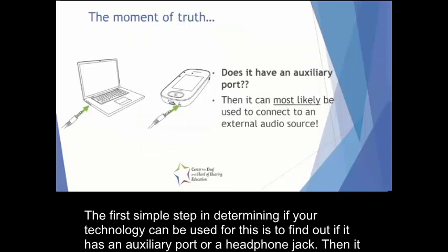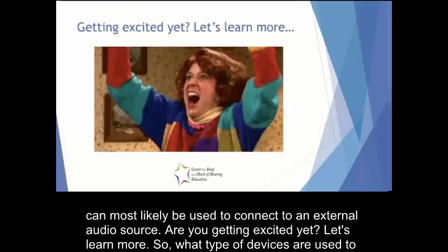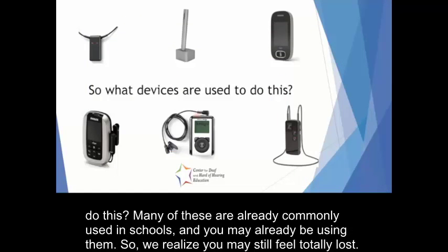The first simple step in determining if your technology can be used for this is to find out if it has an auxiliary port or a headphone jack. Then it can most likely be used to connect to an external audio source. Are you getting excited yet? Let's learn more. So what type of devices are used to do this? Many of these are already commonly used in schools, and you may already be using them.